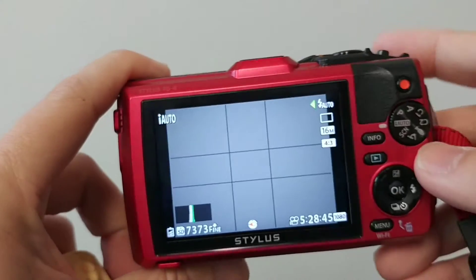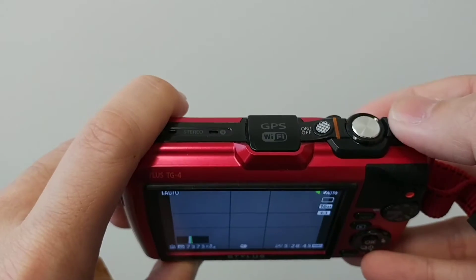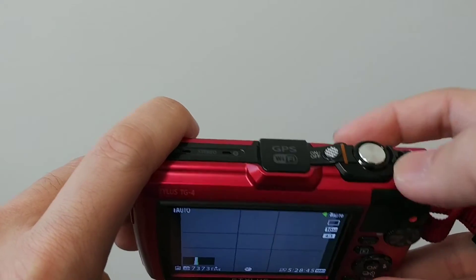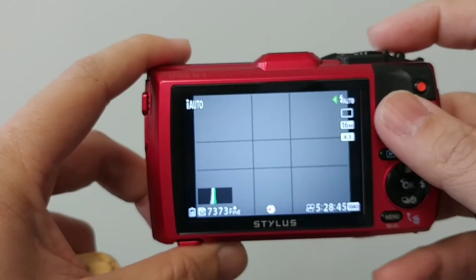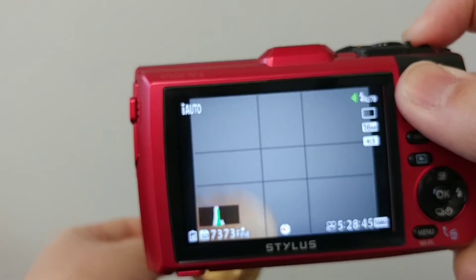On the back side, the controls are very simple: just the mode dial, a zoom, a shutter button, and a power button. The power button has a nice bridge feel to it, so it's easy to turn on and off without looking.